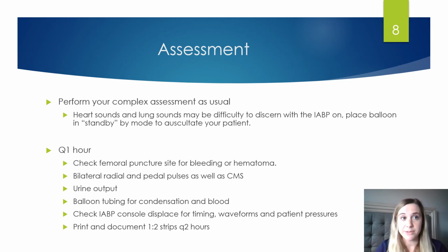These type of patients are obviously going to be in the ICU, so these Q1 hour checks are crucial. Like I was saying earlier, we're going to check that femoral puncture site for any kind of bleeding or hematoma development. If you do see any signs of bleeding, you've got to notify your charge nurse, your cardiologist, or your intensivist who's going to be managing these patients. The best intervention that we can do as nurses at the bedside is hold pressure and wait for everybody to respond. But use your chain of command to get people into the room, as this can definitely be more of an emergent type situation.